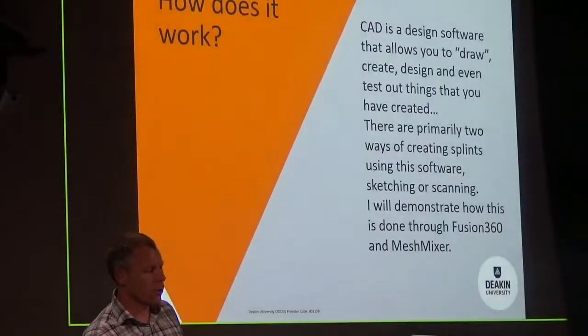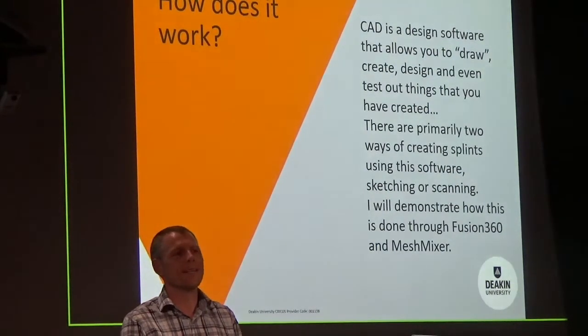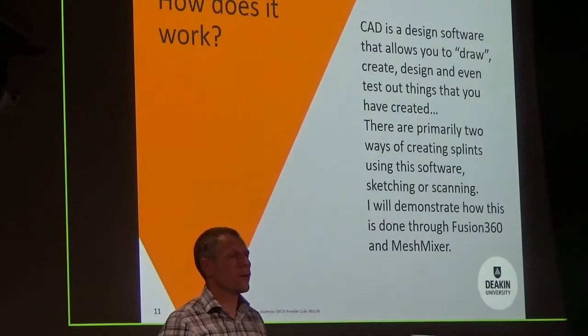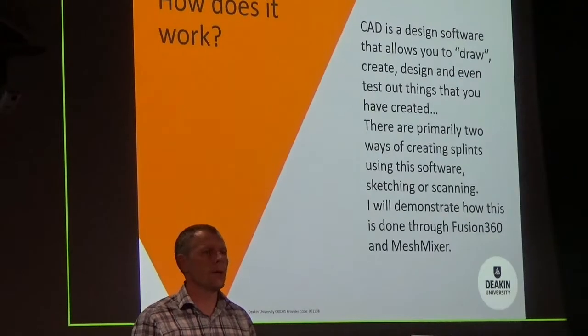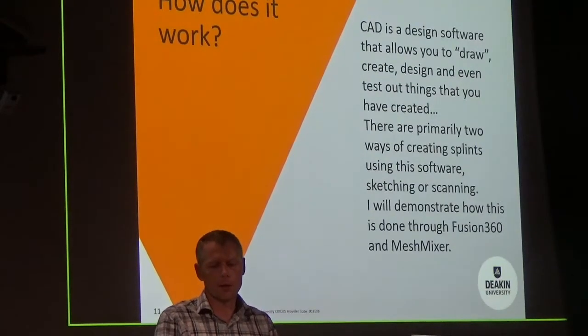So computer-aided design is the ability to draw, create, design, and even test out, as I said, the design process of making whatever you like in part, and in this case looking at splints. So this design on a computer, a bit of software, can take things to a whole new world. It means we're no longer restricted as such. So primarily there's 2 ways of creating splints using software. You can either sketch it or draw it, which I'll show you, or scan it and then manipulate that file or the image that you see. And as I say, I'll show you a couple of ways of doing that. So this video, which will look through. Here we go. So this is Fusion 360 design. It does require a little bit of a strong computer as such, so it has to have a bit of go about it.